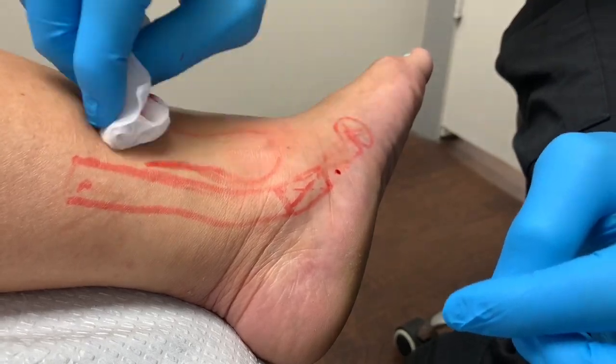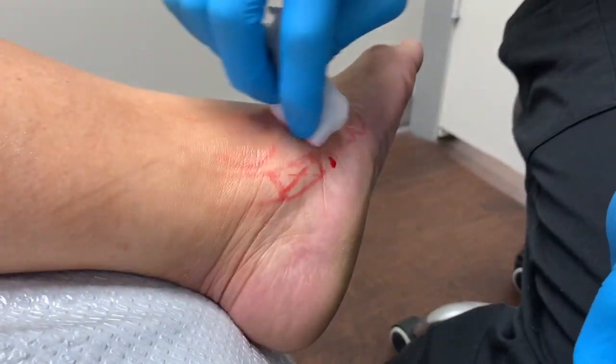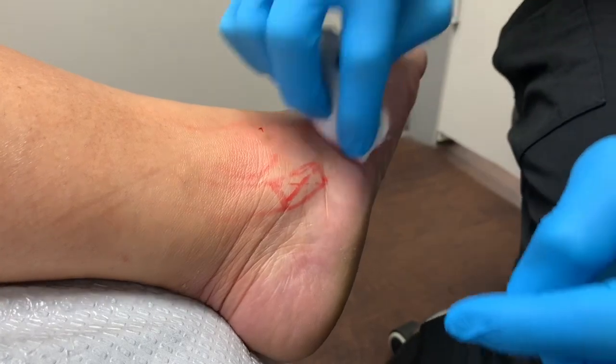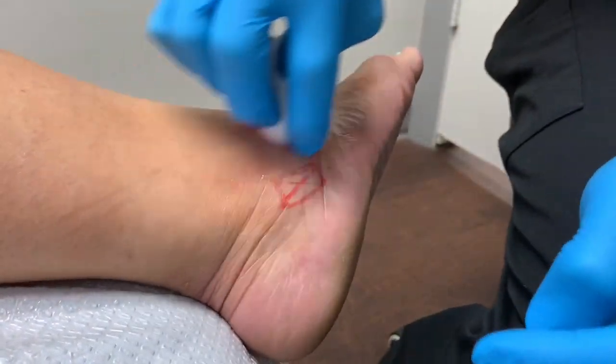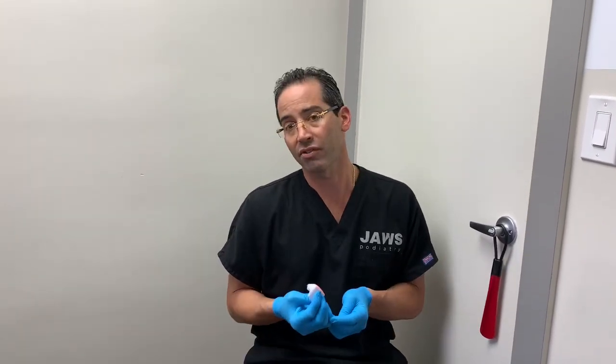Okay, we'll go ahead and clean our anatomical diagram here. Right? We won't touch this because I want all that plasma to stay there. Okay. We're done. Sometimes the patients after, I've said it before, when we turn off the camera, the patient will say, just go ahead and take the rest and just infiltrate it, and we'll see how she feels about that. But again, more is not necessarily better in this particular case.